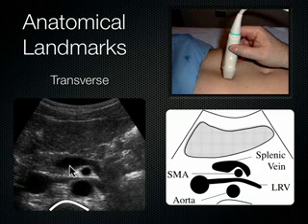So that's where that splenic vein is going to become the portal vein eventually, when it meets up with the superior mesenteric vein. Again, I realize you haven't had that anatomy yet, but you're going to start to see all these things on ultrasound really soon, so I think I should point them out.